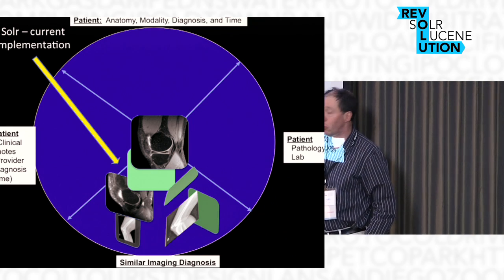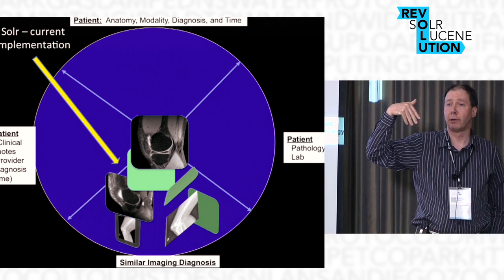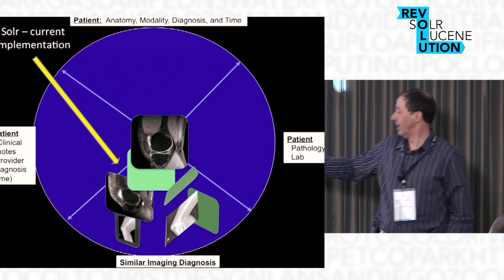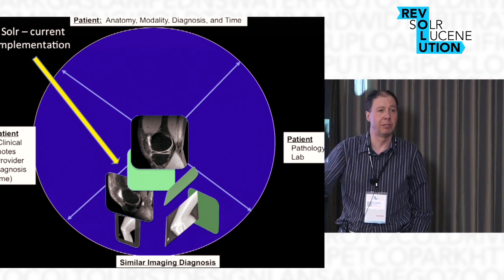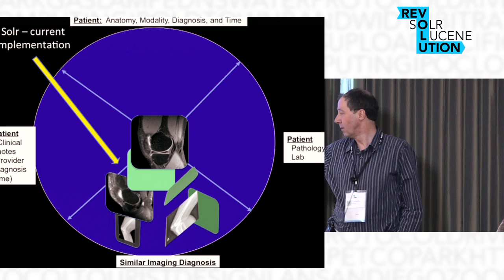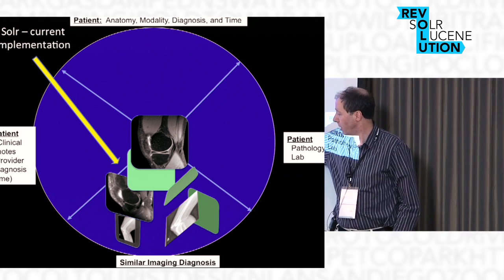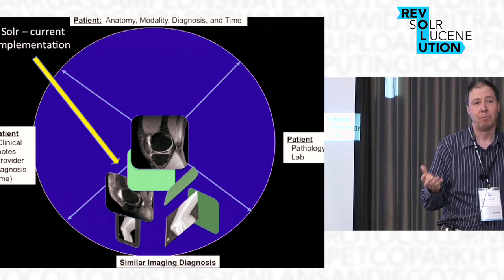These are images that we've pulled up based on the Solr search that brought up the particular data records. This is a plan that we've got for implementation of this workstation in the fall. Right now we're proving the concept using LucidWorks, and we're getting the results in the record format that we're interested in. But our next step is to then insert this into this GUI so that we can make use of the radiologist information.